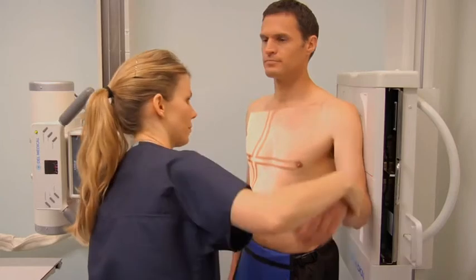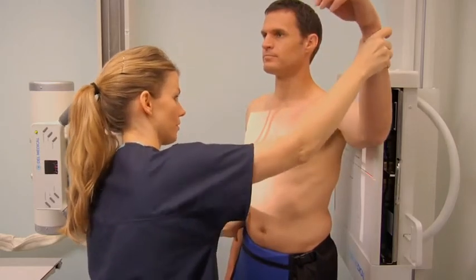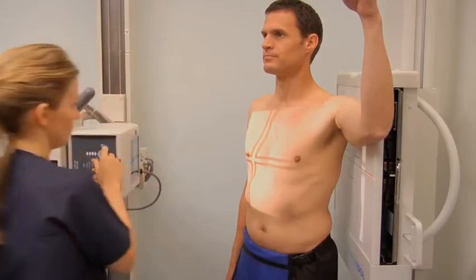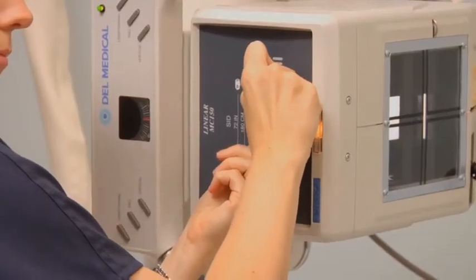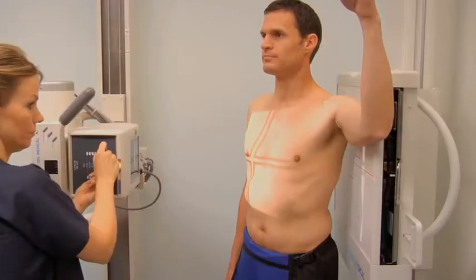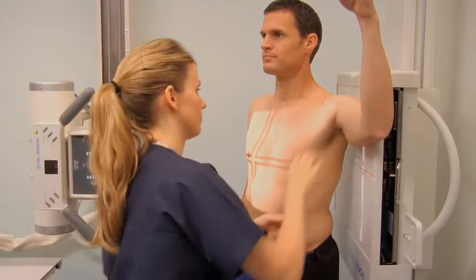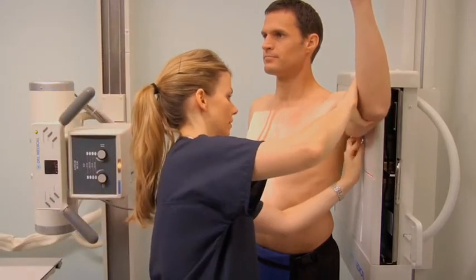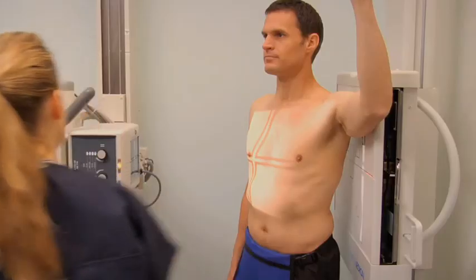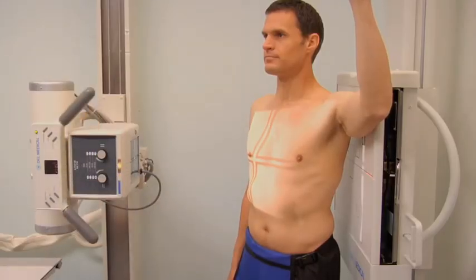With their left side touching the image receptor, ask the patient to raise their left arm with the elbow bent. Collimate to 1.5 inches above the shoulders, including the right and left lateral soft tissue borders of the left ribs and the diaphragm if possible. Position the left lead marker on the upper left corner of the collimated light field of the image receptor.